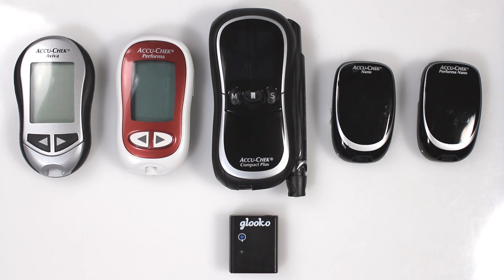Welcome to Gluco. In this tutorial, we're going to show you how to download your meter to your mobile device with Gluco Meter Sync Blue.